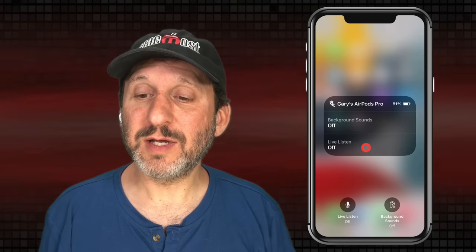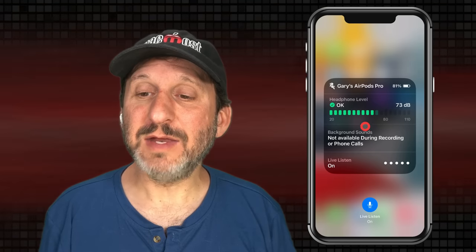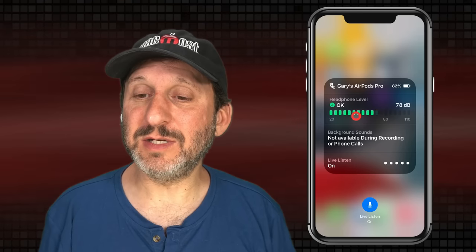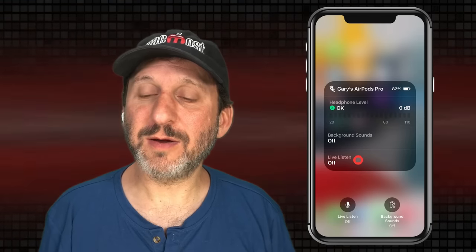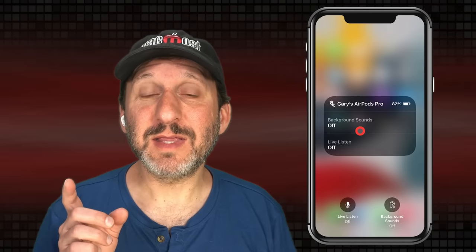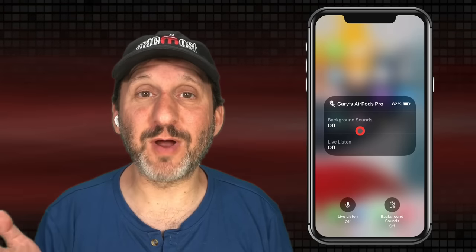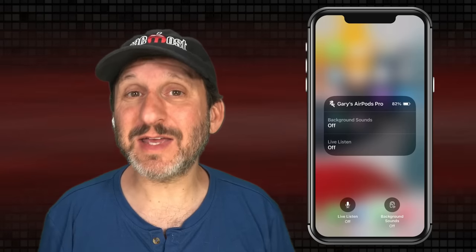To turn it on, just click here and it turns on. You can see the input level coming in here. It will tell you if the sound level is too high, and it's easy to turn it off as well. Basically what's happening is the iPhone is trying to listen for voices and amplify them while trying to drown out background noise and other distractions, so it makes it easier to hear people — kind of like a hearing aid.